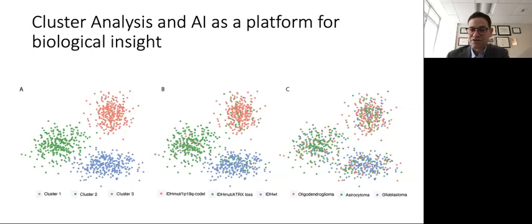The cases we're most interested in are those that the AI associates with, quote, wrong genetic cluster, those that are, quote, misclassified cases of patients who might have a prognosis that is unexpectedly long in the case of IDH mutant tumors with ATRX loss that the algorithm puts into a cluster predominantly with 1p19q co-deleted tumors. In this manner, we feel unsupervised learning can become a method for generating a more nuanced understanding of human glioma classification that goes beyond just morphologic and genetic criteria alone.